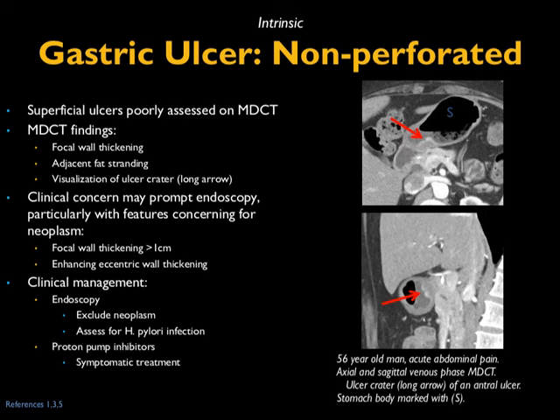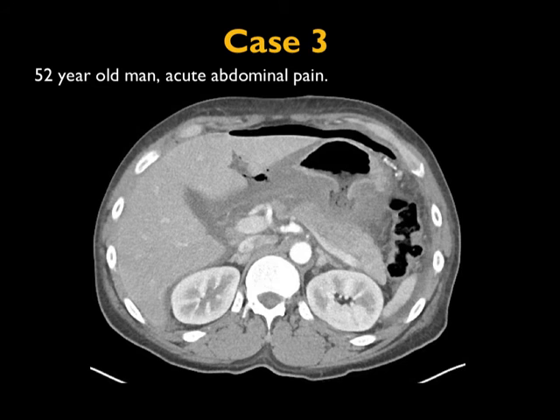You see focal wall thickening, minimal adjacent fat stranding, and you can see the ulcer crater in this case. Patients will typically get endoscopy, particularly if there's any suspicion of neoplasm. Clinical management involves excluding neoplasm, assessing for H. pylori infection, and typically placing patients on drug therapy with proton pump inhibitors.